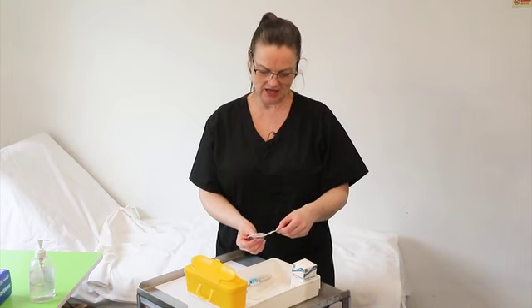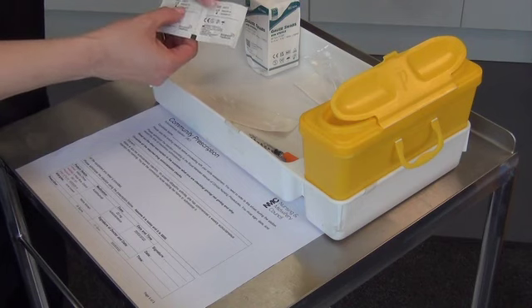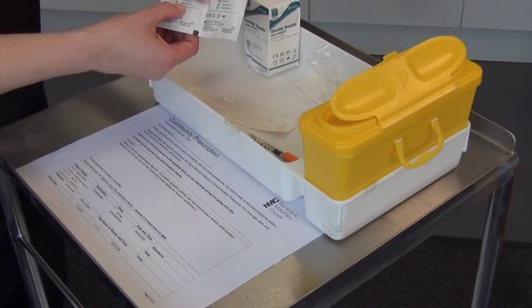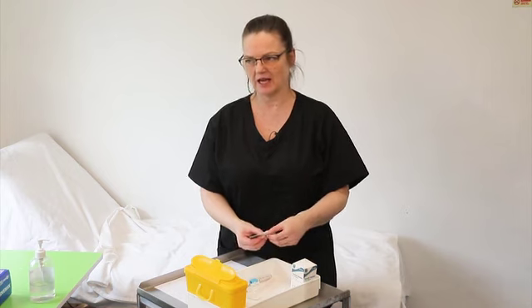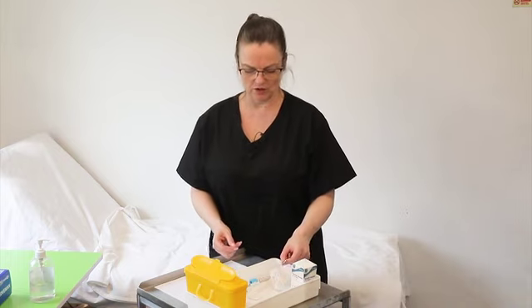This is an alcohol swab, and again, it does have dates on it. So you're looking again for the egg timer symbol, and do check. It gives extra reassurance to the examiner that you're competent and you're safe and you know what you're doing.